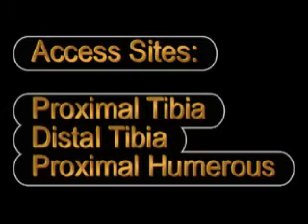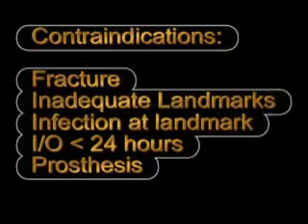The only exception with the pediatric client is with the proximal humerus. This can only be used if the landmarks are properly identified.